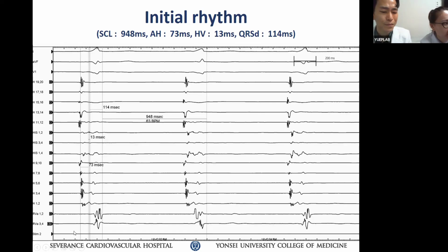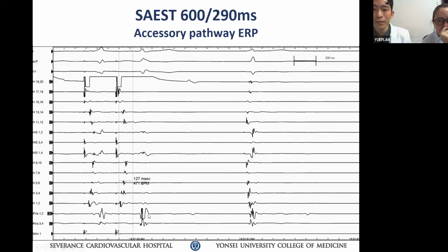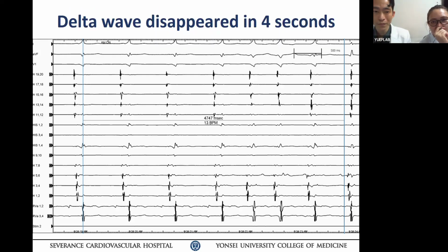If I was looking at this, I would ablate right there. No. It would be done. Trust me. No. Your signal is on the other side. I eliminated the potential with a single burn. Yeah, but show me the tracing, the last one. Last ablation signal, you had the last slide. That's always my question. Why did this guy not burn that area and move around? Oh, it is not the perfect catheter position.